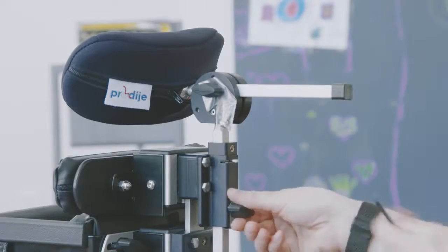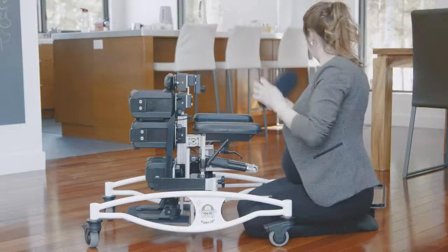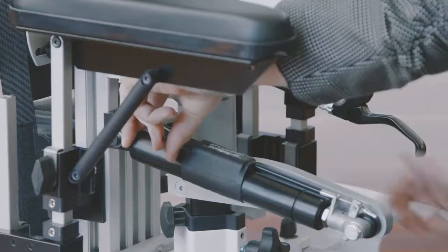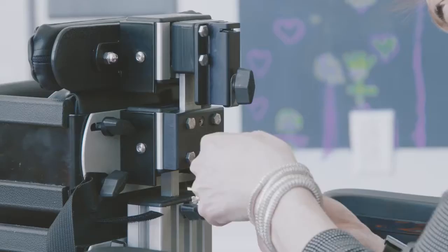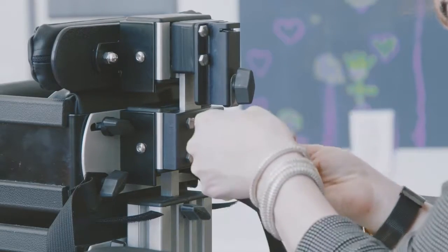Remove the headrest by loosening the adjustment — use the allen key if necessary. Then undo the two screws with the allen key in the shoulder support plate and remove it entirely.